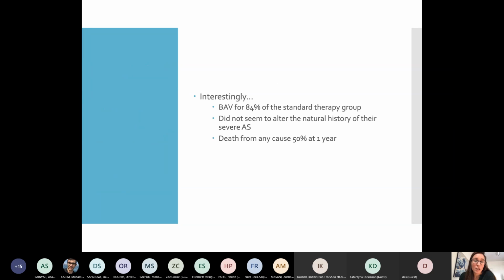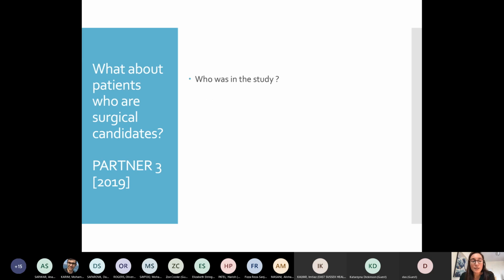Okay. So that's talking a bit about the initial premise for TAVI in frailer patients who aren't surgical candidates. So opening up a line of treatment to a lot of these really symptomatic people with quite high mortality if they're not offered any intervention, and saying, look, we think it's safe and it improves outcomes. Again, not very relevant to our man, Mr. TS. So last year, there are a couple of studies, one of which was the PARTNER 3 study, which looked at surgical candidates, so people with low surgical risk.